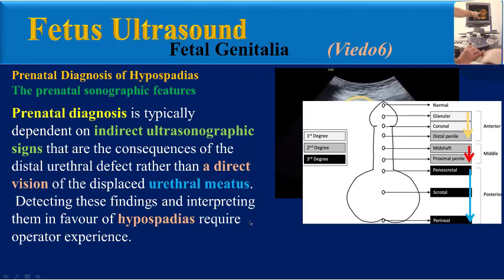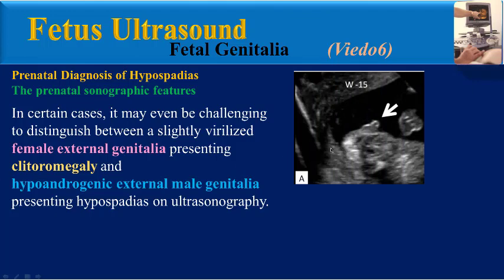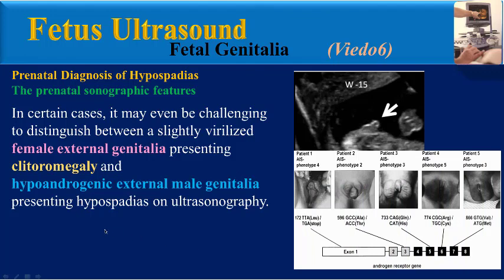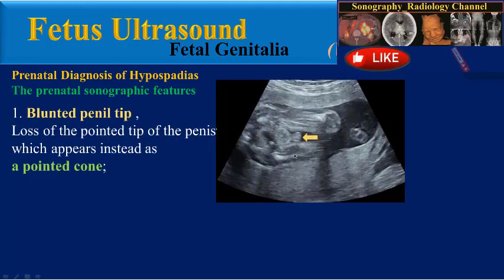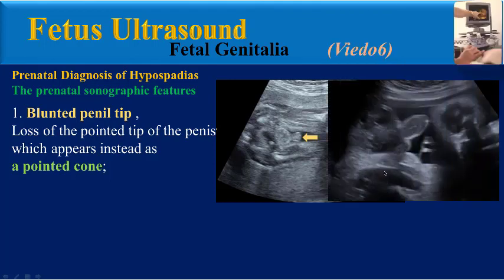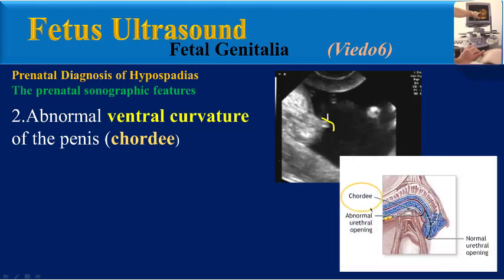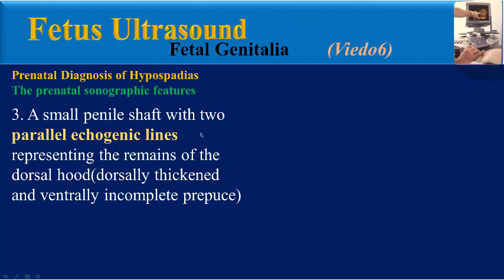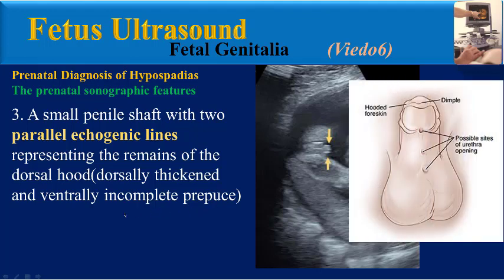Detecting these findings and interpreting them in favor of hypospadias requires operator experience. In certain cases, it might even be challenging to distinguish between a virilized female external genitalia presenting clitoromegaly and hypoandrogenic external male genitalia presenting hypospadias on ultrasonography. Therefore, prenatal misdiagnosis is quite common. One sonographic feature is a blunted penile tip — loss of the pointed tip of the penis, which appears as a pointed cone in a normal fetus.